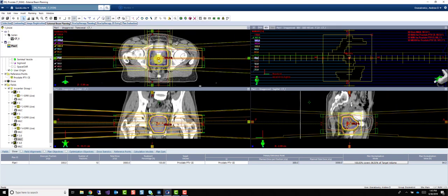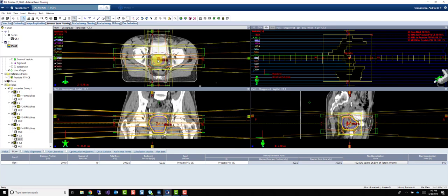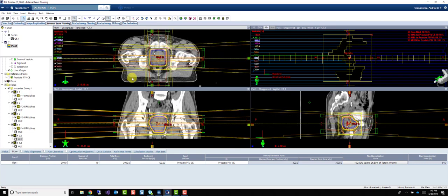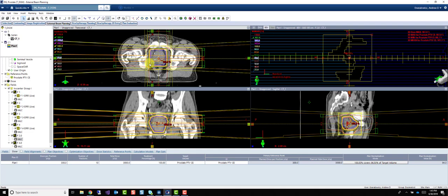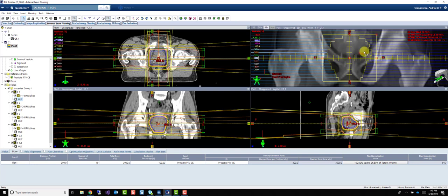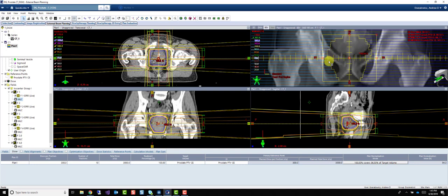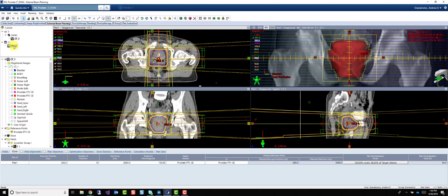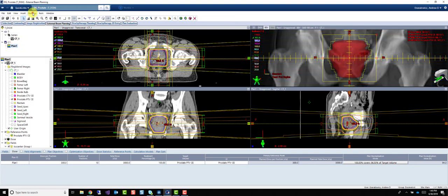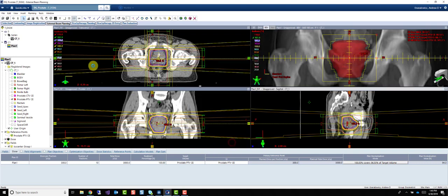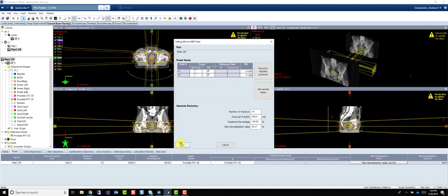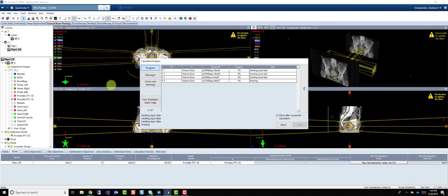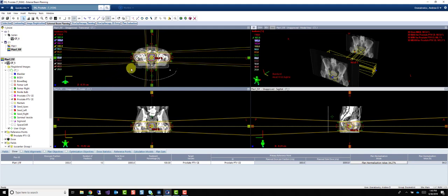This is just a good example. It shows you by adding more fields. The more fields we add, the more conformal we can get, and the tighter we can make these margins around our volumes, which is good, because then we end up treating less normal tissue. To finish this plan up, I would merge my subfields. And we are done.